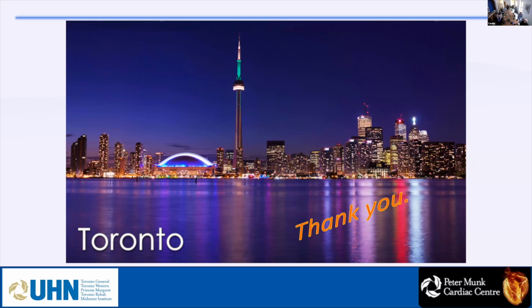No, I'd like to hear from you. So we have to use it. These measurements are new. I don't know if we can use artificial intelligence to measure. It would be very good, especially for the free margin. Yeah, these are hard. Because with the free margin, we still cannot do it very accurately. I asked the surgeon to measure it. We have to see the way that they measure it: they stretch the leaflet and measure it by a suture. And the way that we measure it, maybe we are not stretching enough. We are always underestimating. But we have to find a way. Yeah.